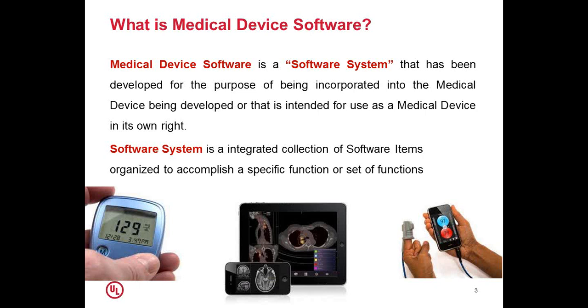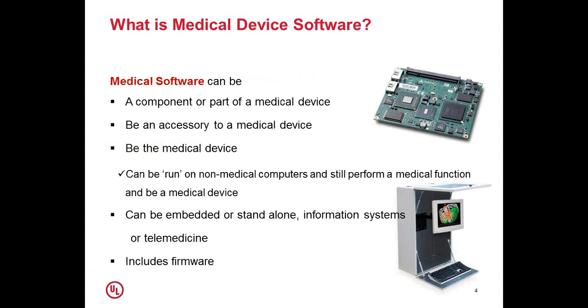As we go further, we can see a medical software can be a component or a part of the medical device itself, or an accessory to the medical device. That is, in certain cases you will find the software application which is outside the part of the medical device, for diagnosis or for therapeutic use. And software can be a medical device by itself and can be run on non-medical computers and still perform a medical function and be a medical device.